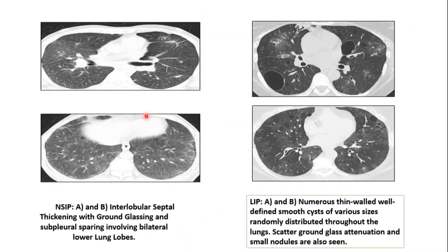Next is non-specific interstitial lung disease. On HRCT, there will be various combinations of ground glass opacity, consolidation, reticular opacity, and traction bronchiectasis. Honeycombing may be present but it is very rare. One of the classical features is subpleural sparing of changes within the lung parenchyma. In this set of images showing NSIP, we can see interlobular septal thickening with ground glass opacity and subpleural sparing involving bilateral lower lung lobes.